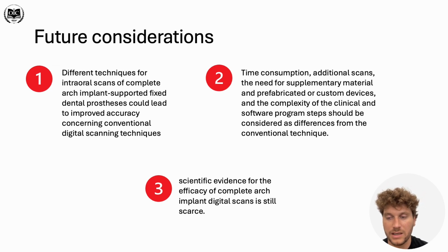And regarding the research on these topics and the accuracy of these cases, there is a big struggle. Even though the number of scientific publications is large, we don't have a standardized way to assess the accuracy of these kinds of procedures, and we have difficulties getting information from the manufacturers on how these post-processing and stitching algorithms work. So there's definitely a space and a need for this kind of research in the future.